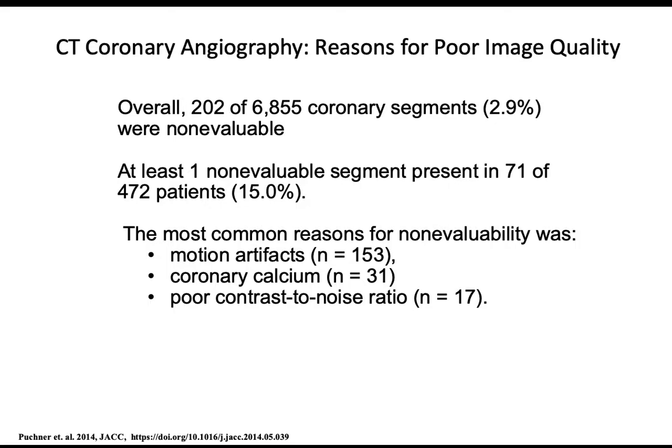And so you can kind of approximate that transit time. There are techniques to monitor it and try to tell the scanner when to go. But the biggest crux, I think, in the whole problem is that once you say, okay, I think it's in the lungs, it's going to soon make it to the coronaries, you have to ask the patient to hold their breath. So you make the decision to go, let's say 8 seconds before, you then say, okay, now take a deep breath in, take a breath out, and hold your breath. You can't just be waiting and immediately scan. You're asking someone to hold their breath, and you can't ask them instantaneously, you have to give them a heads up, like I'm going to ask you to hold your breath for 10 seconds. So that mistiming could mean that you shoot too early or too late, and now the contrast is lower than you wanted.